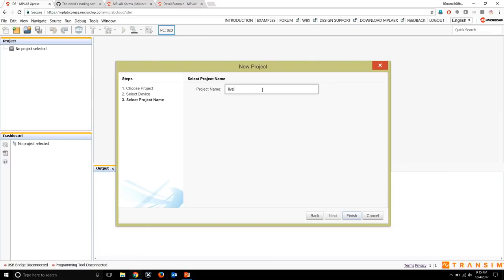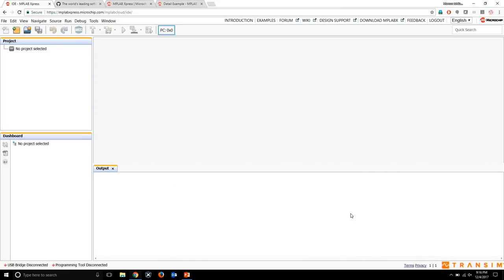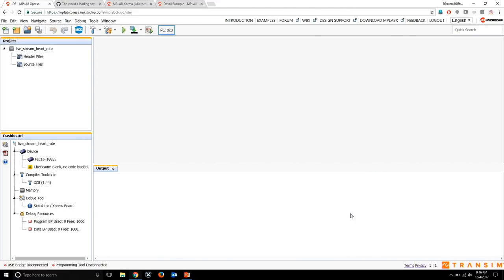I'm just going to call it stream. Live stream. It does not take spaces. Stream heart rate, how's that? All right, so we're going to make a heart rate monitor. Let's click Finish. All right, so we have a project created already.